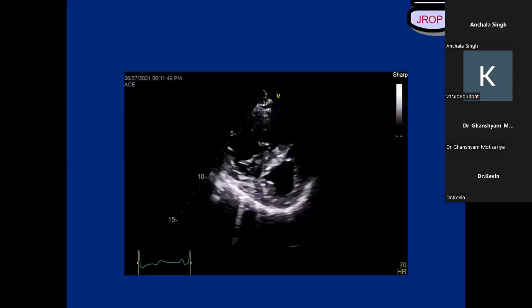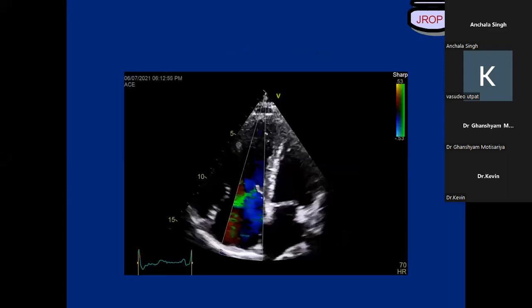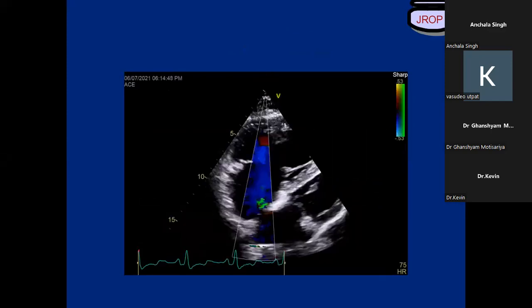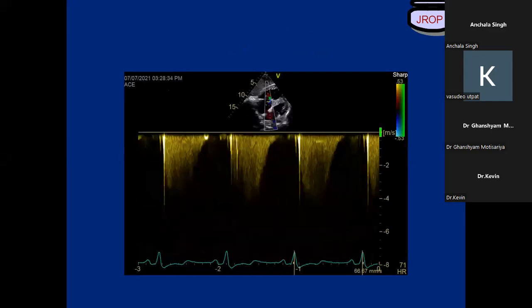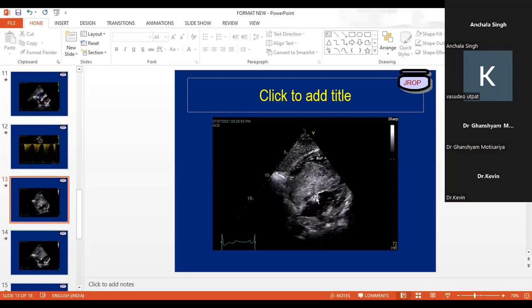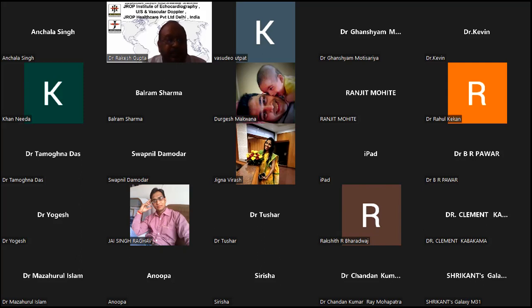So this is a patient of post ASD closure. I don't know why they're not playing, but let me go to that particular film. If you look carefully over here, you find this kind of a patch in these post ASD closure people. But you have to have a history, otherwise you cannot decide whether these people have got a post ASD closure or not. This is easy because once you get the history, look at this hyperechoic shadow seen over here. That is a fossa ovalis defect, which was closed surgically. Now let me show you something more than this.